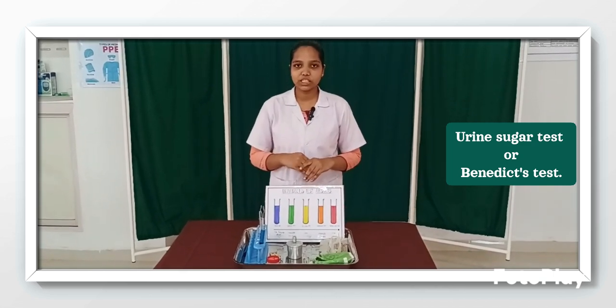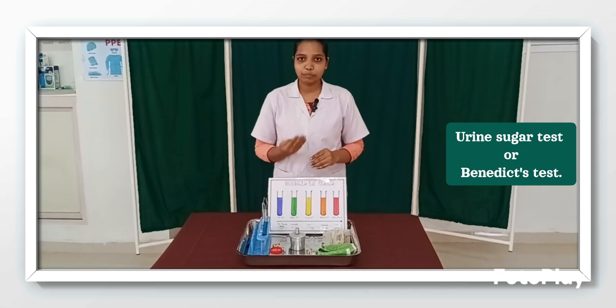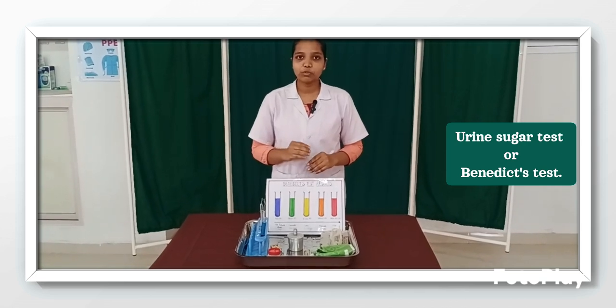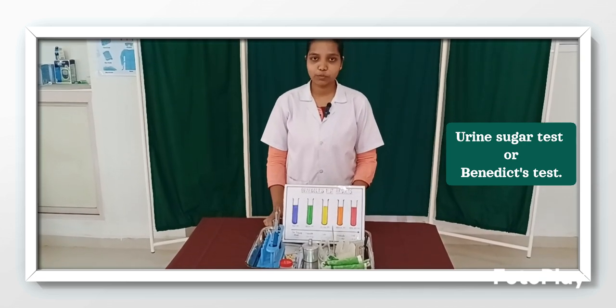Next, we are going to see the preparation of the patient. We have to explain the procedure to the patient first. Then we have to ask if they need any help. Then we have to instruct them to collect midstream urine. Let's see the needed articles for the procedure.